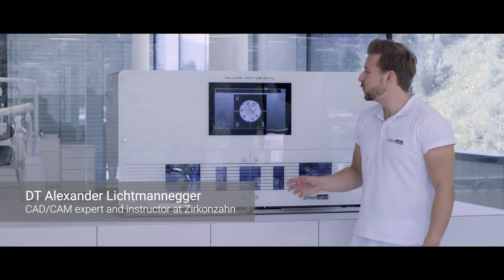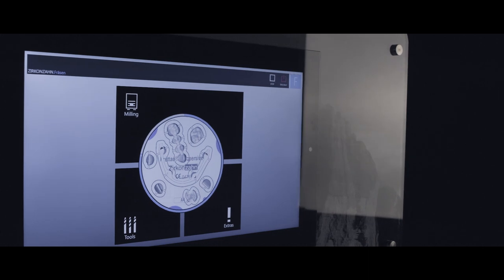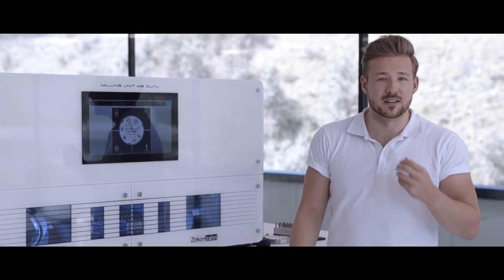Let me explain the latest features of our new M2 Dual Teleskoper machine. First of all, we integrated the PC directly into the milling machine for a good reason — to make it more user-friendly.